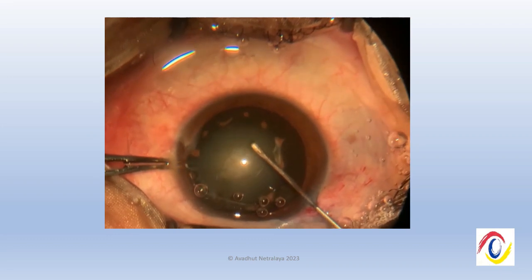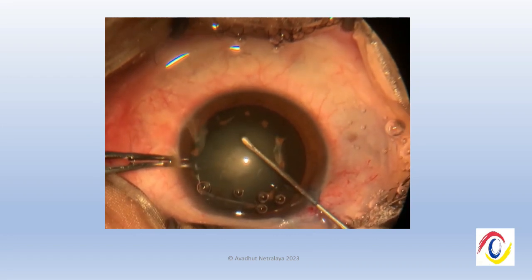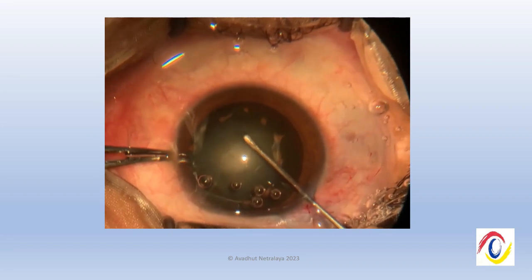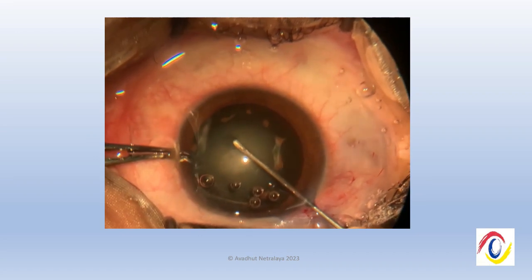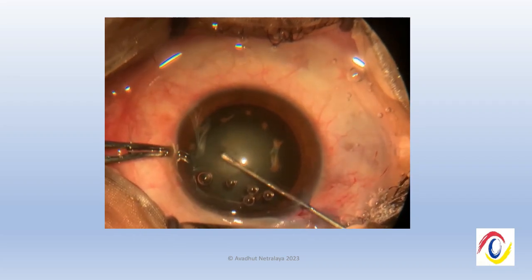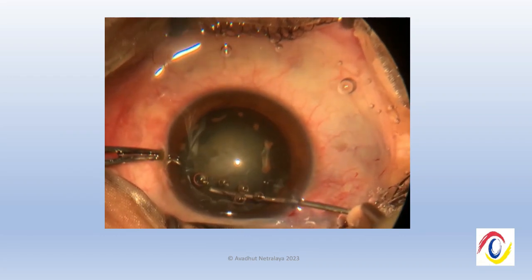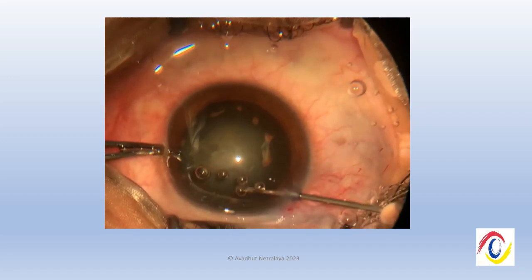We decided to start doing the capsulorhexis, and as you can see there are certain rust deposits or iron deposits on the anterior lens capsule, and also a central plaque which reveals that the intralenticular structures are probably adherent to each other. We initiated the rhexis with a flap, but the anterior lens capsule was firmly stuck to the cortex, making a continuous curvilinear capsulorhexis not possible.